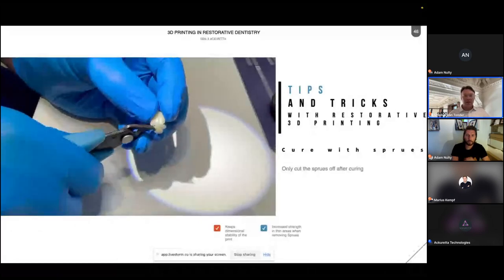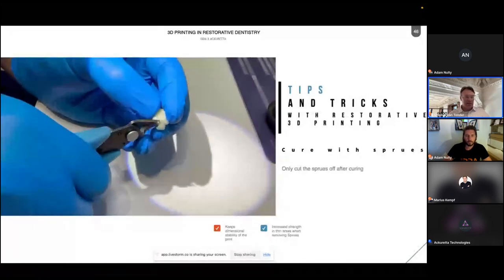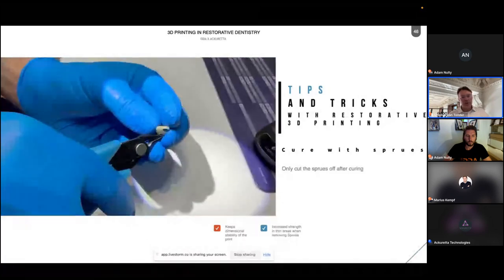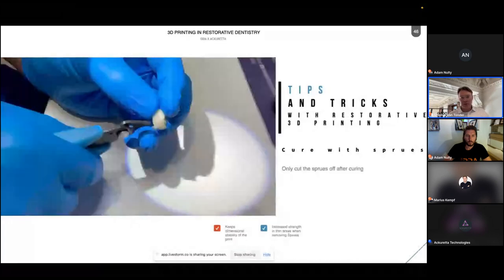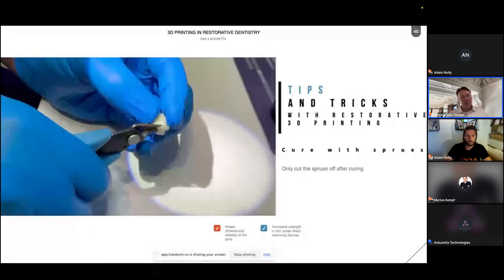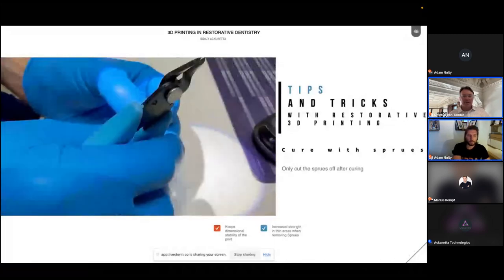Right. So yes, and then this tip is cure your restorations with the sprues on, because in this case the restoration is really thin. If you cut the sprues off before you cure it in the light, it might be so soft it just breaks away. So it keeps the dimensional stability of your print, and it also increases the strength in thin areas when you are removing it, so it makes it less risky to cut the sprues off and damage your restoration. The next slide, Adam.